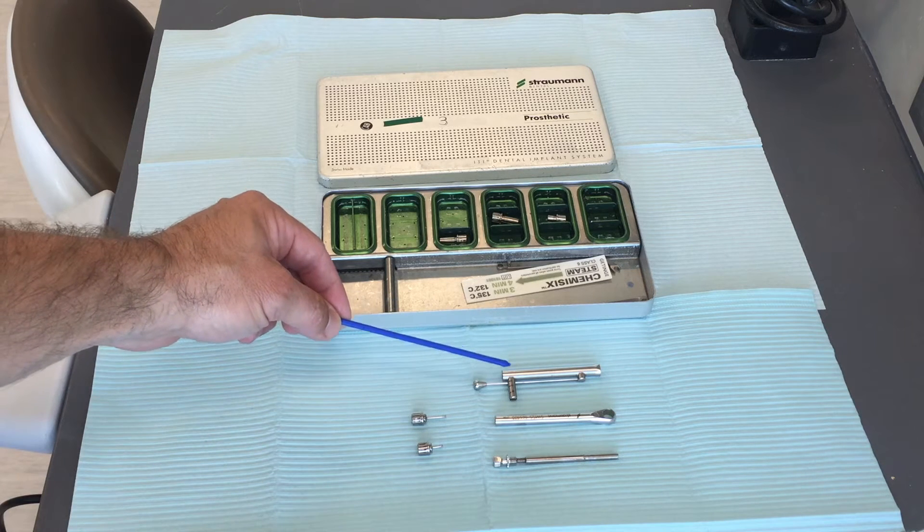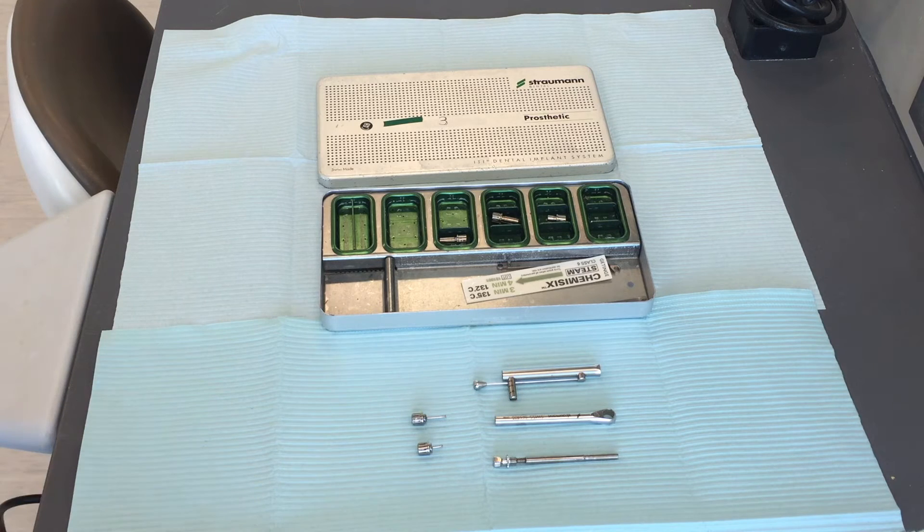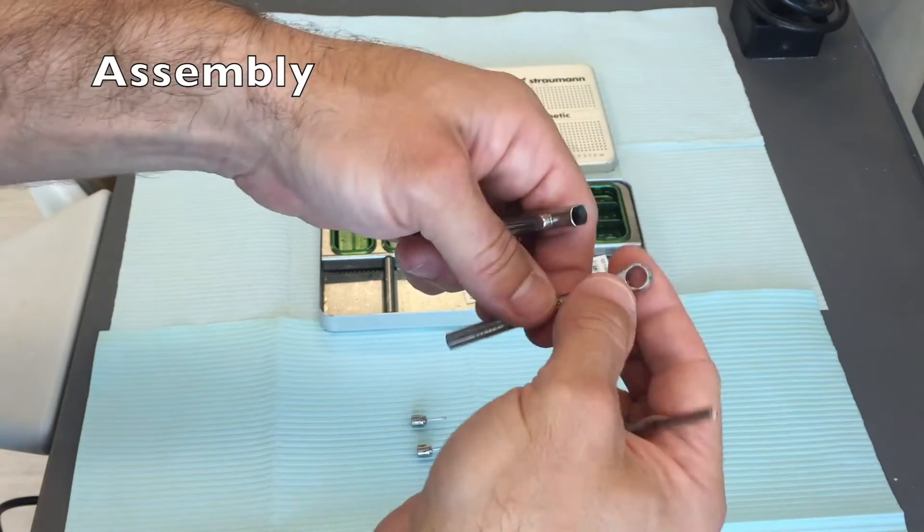When making an impression, you're typically only going to need the implant driver to remove your healing abutment and then place your impression coping. The torque wrench is typically only going to be used when delivering your final prosthesis.